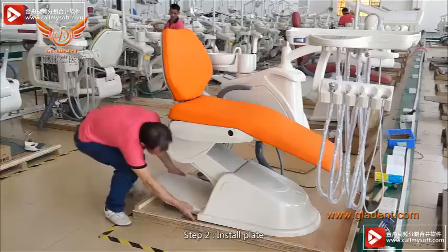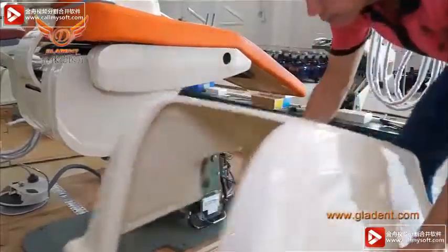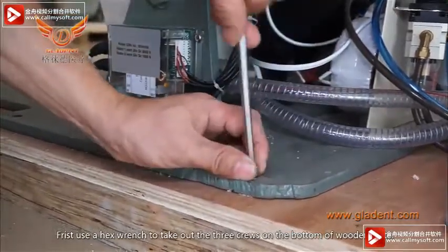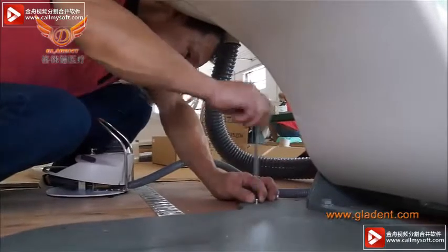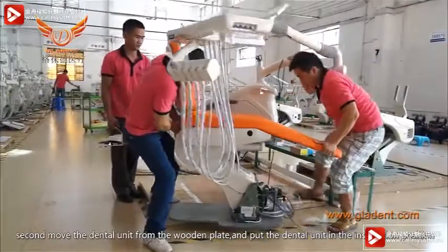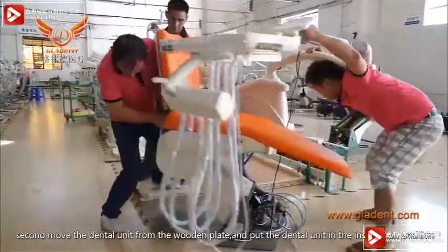Step 2. Install the plate. First, use a hex wrench to loosen the three screws on the bottom of the wooden plate. Second, move the dental unit off the wooden plate and place the dental unit in the installation position.